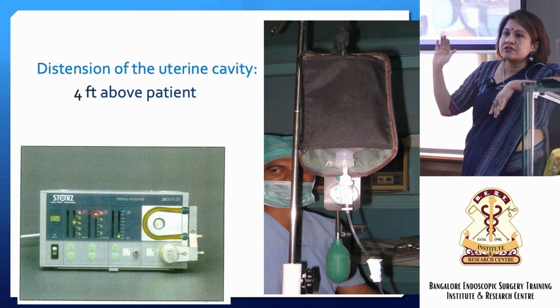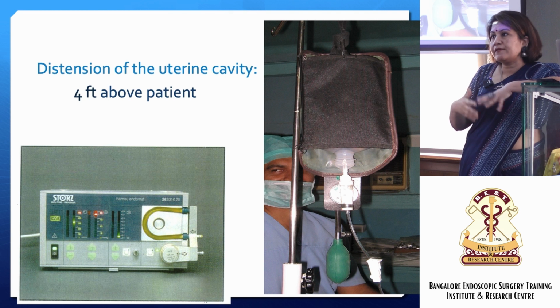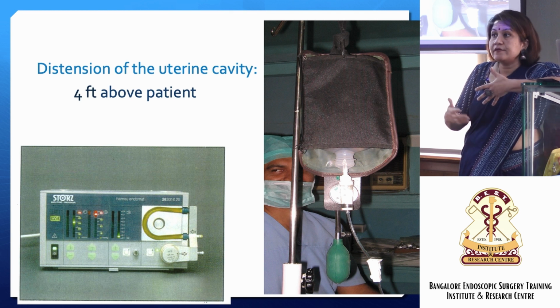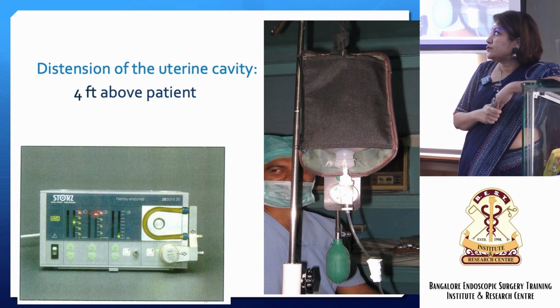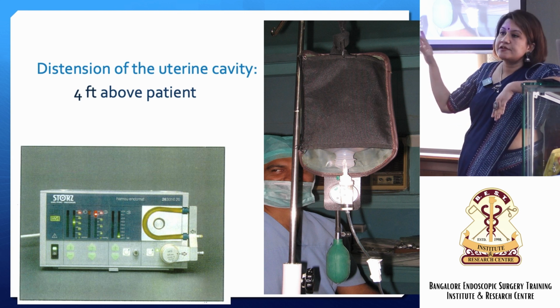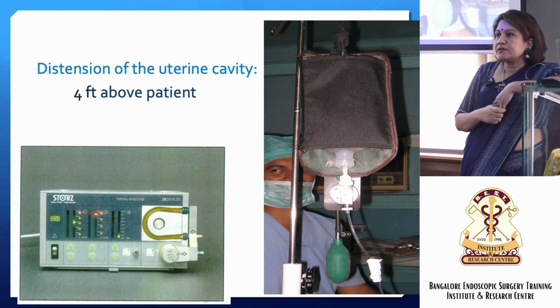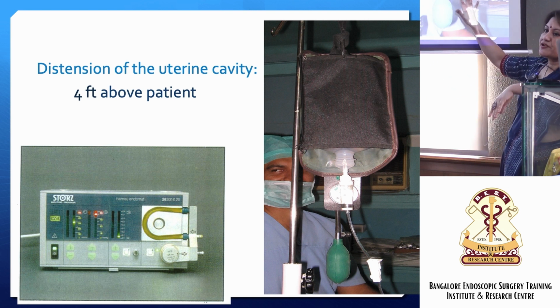But most hospitals will not invest, because unless your turnover is huge, unless you have a personal one, you invest yourself. When you invest, you are looking at turnover, right? Most of the hospitals will talk about return on investment, right? So very few people have a hysteromat in their OT, unless you are yourself a big laparoscopy person, have your own hospital and can afford to use it. Otherwise, most of them end up using a simple pressure cuff.